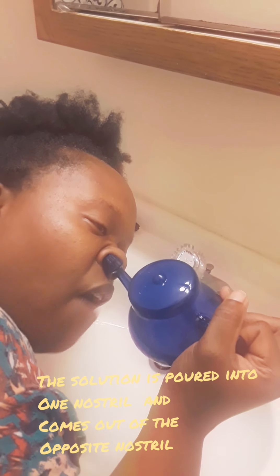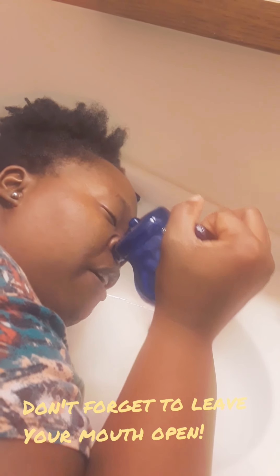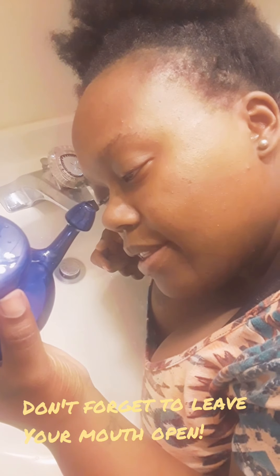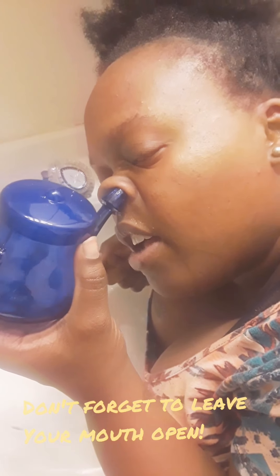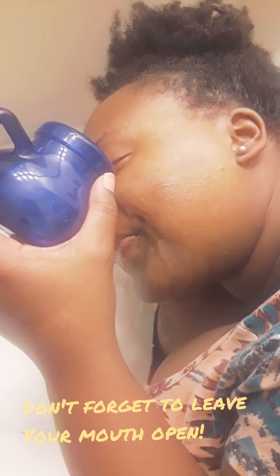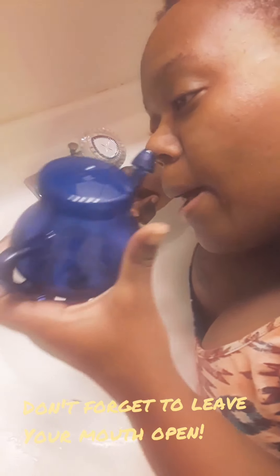At the very end of the whole neti pot session, don't pinch your nose — just blow it very lightly. Now doing the other side: put it on your nostril, hold your head to the side, open your mouth, and pour. Remember to suck up a little bit at the end. And I'm finished with the neti pot.